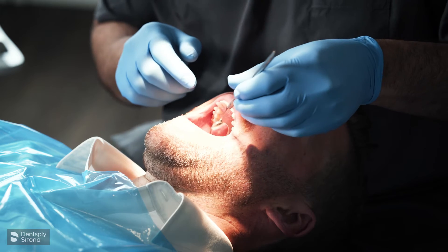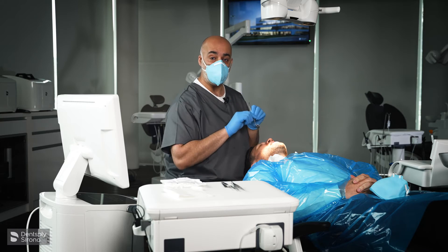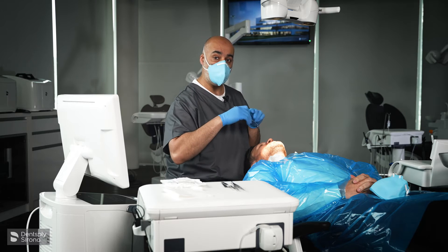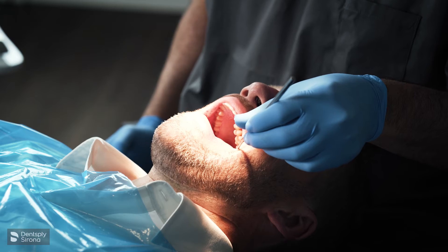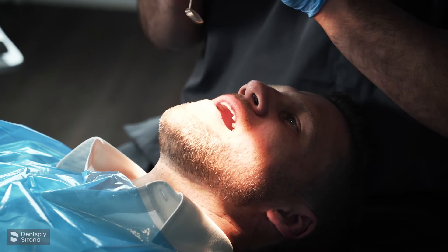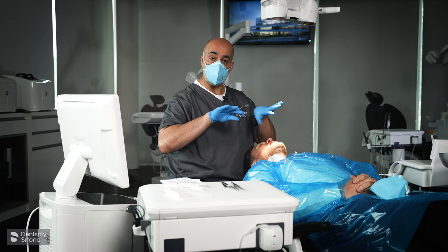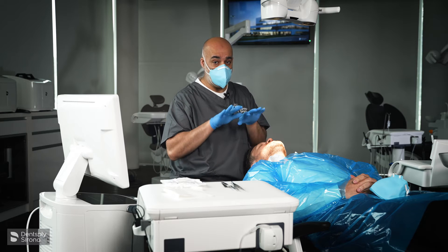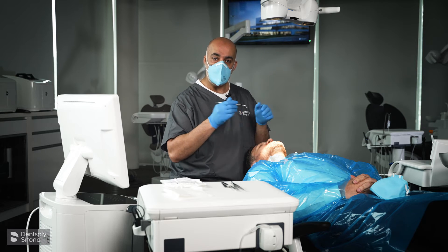I'm going to use my mirror and we're just going to have a look inside to see whether the cheeks are starting to cover the last tooth. If they have a wisdom tooth you'll find that the cheek will cover that, so you will be using your mirror to pull things out of the way to get a real good scan of the last tooth in the arch. We're also looking at the tongue to see whether that encroaches, and we're looking at the arch width — if the arch is quite narrow the tongue will start to fold over the teeth, so we're going to be using a mirror to retract.